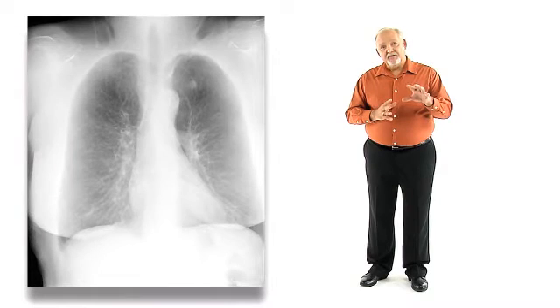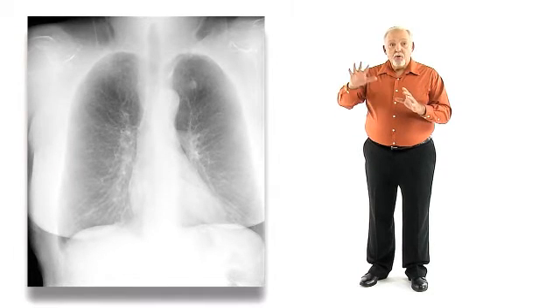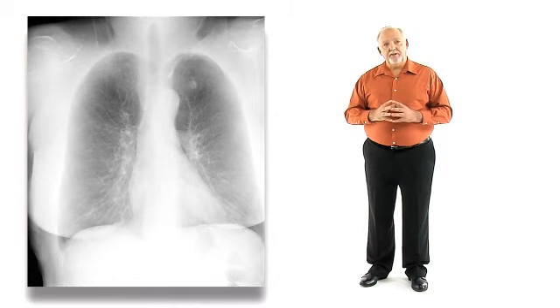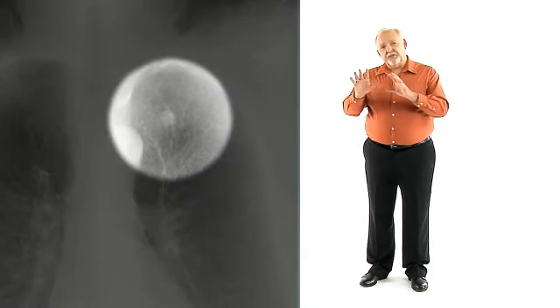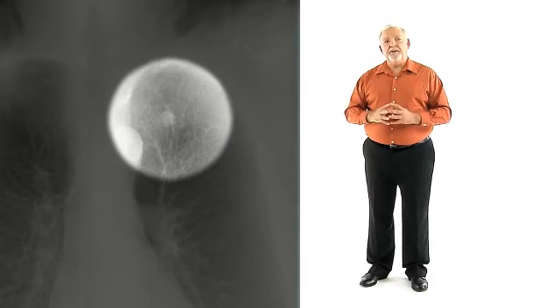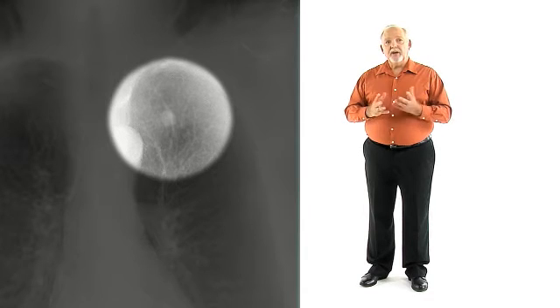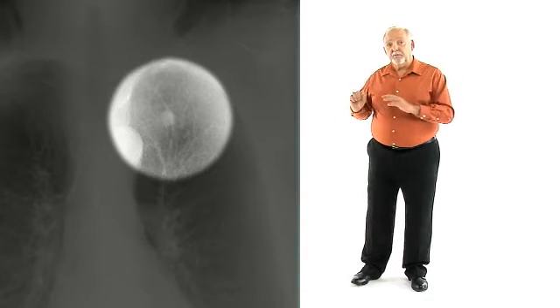Through dual-energy subtraction, the bone anatomy was removed, increasing the visibility of the tissue-based anatomy. A 12-millimeter nodule was discovered lying directly behind the area of concern, ruling out the possibility of a rib-related bone growth.